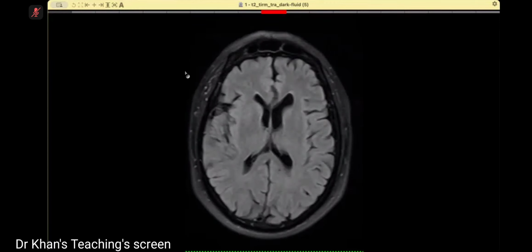So what is your conclusion then? So this is likely, conclusion could be amyloid angiopathy, and okay, we stop there. Thank you.